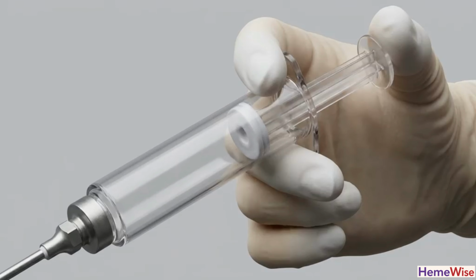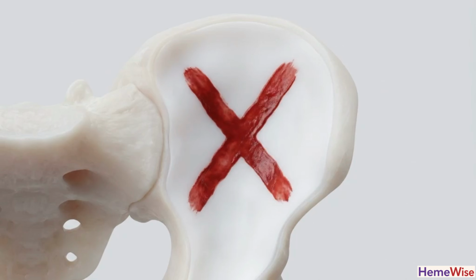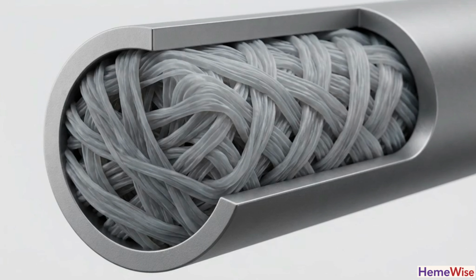The opposite physical failure is the dry tap, where the needle is positioned correctly and negative pressure is applied, but no liquid is obtained. A dry tap does not indicate an empty or aplastic marrow cavity. It is a failure of fluid flow, not necessarily a lack of cells.